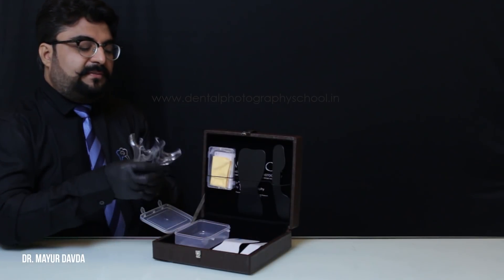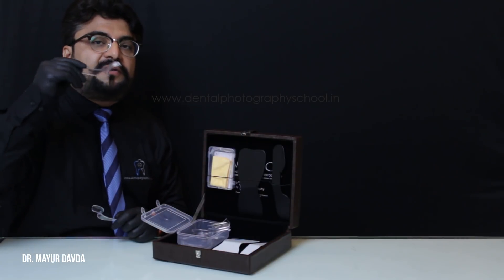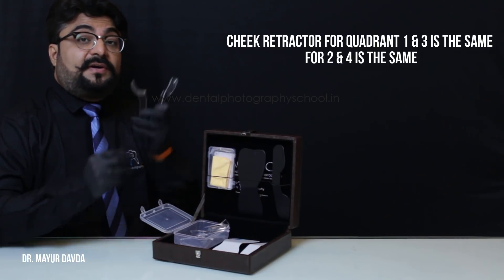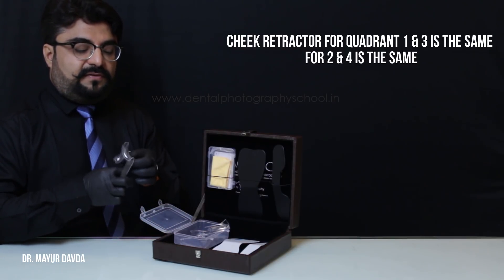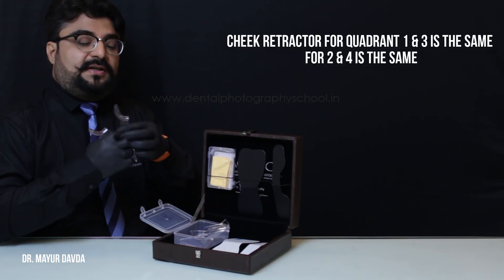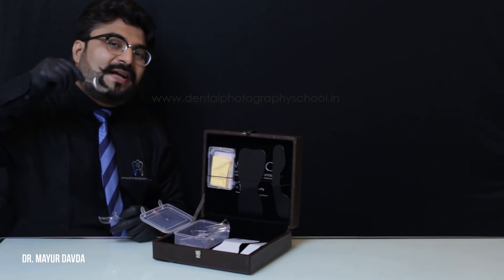We also have the sectional cheek retractor or quadrant cheek retractor. We have one cheek retractor for the first quadrant — the same one is for the third quadrant — and then we have one cheek retractor for the second quadrant, which works for the fourth quadrant as well.